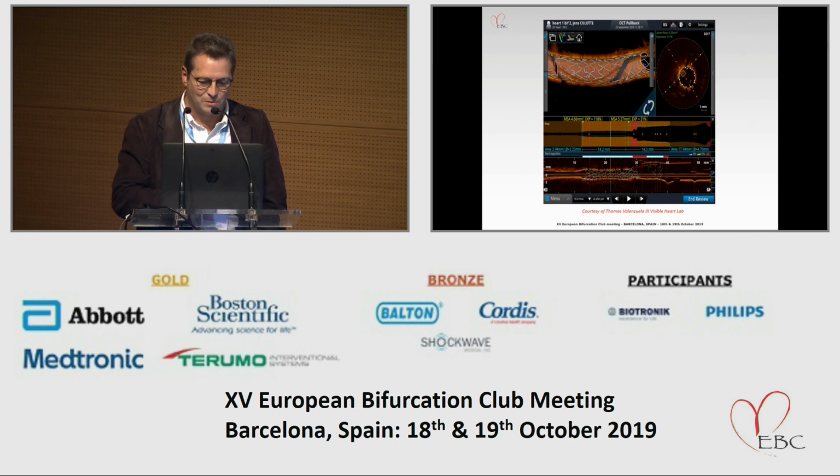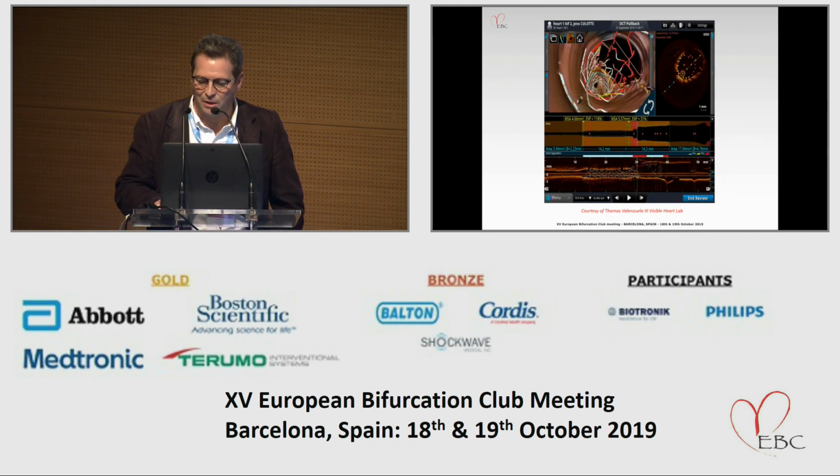And again, it's possible to see how nicely the stent is opposed in the distal part and how chaotic it looks in the proximal part. And if we go here, we can see the floating struts across the takeoff of the side branch, and we can see that there's huge malapposition in the proximal area, not surprisingly, because the vessels are tapered. And again, in more detail and from more distance from the same run, the reconstruction. And again, as you can see, Thomas went over to Francesco in Rome and made a huge amount of work with Francesco to make this picture available for this session.